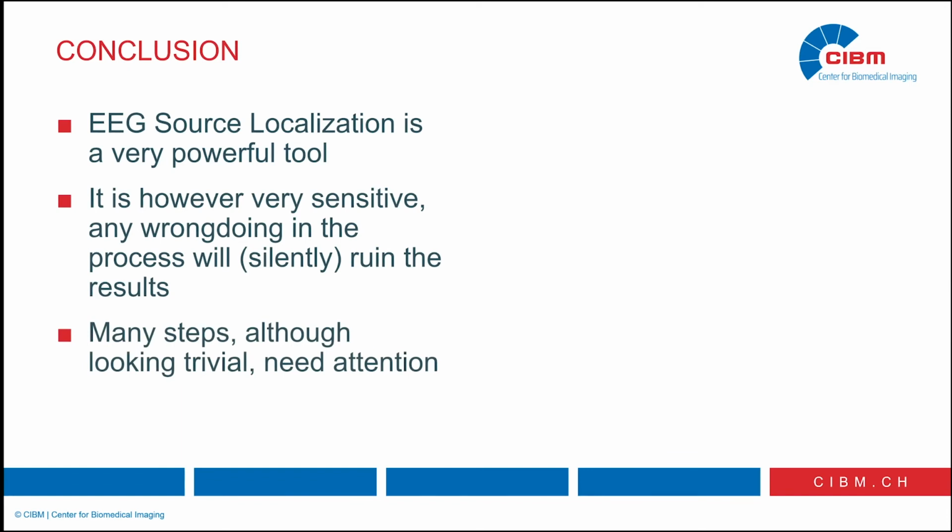And as I showed in these 4 steps during the presentation, basically it's about geometry: the MRI geometry, the XYZ electrodes geometry, the solution space geometry. It's very trivial for a science researcher like you, there is nothing challenging in that. But from an engineering point of view, you want a package that works with very difficult cases, and it's actually not trivial at all to fix.